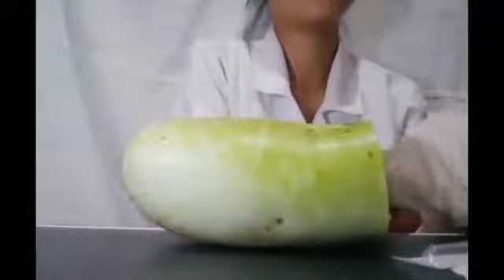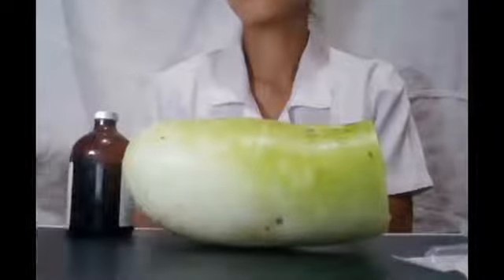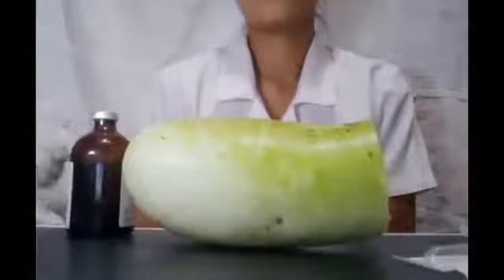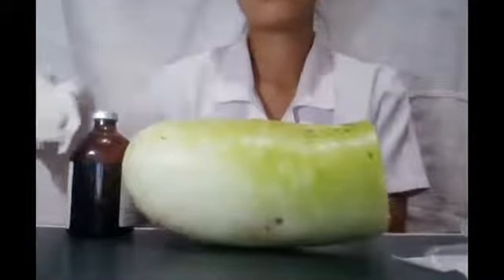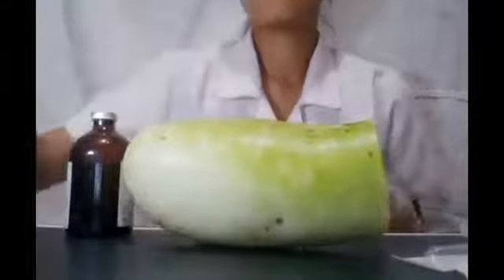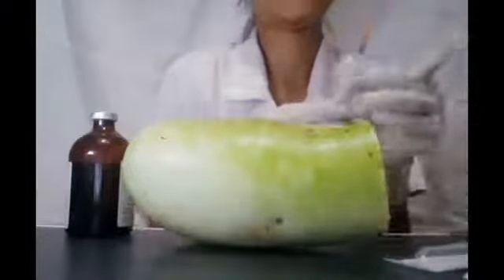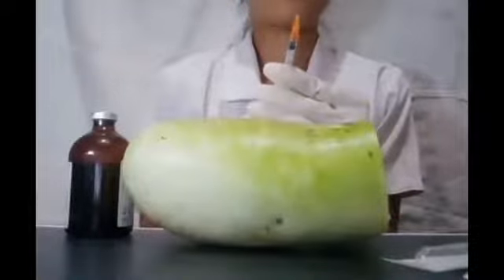First, I have here the vial. We will wipe it off with alcohol, and then we're going to draw back 10 units of air, and then we'll inject it.